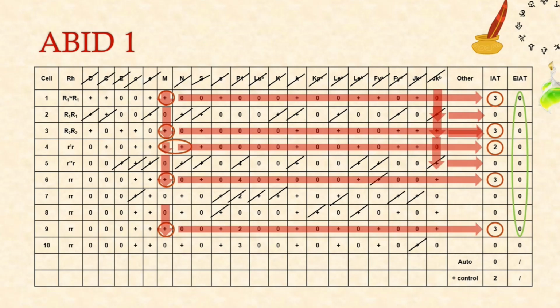Then what we're going to do, we're just going to take a quick look here at the M that we've possibly, anti-M that we've possibly identified. And just look at a few clues that would just confirm. Obviously, you would have to phenotype your patient, provided they hadn't been transfused recently. It'd be okay to do that using your anti-serum. So the first one, we've got this nice positive reaction, quite strong, 3+. Go down, we've got another one there that's 3+.